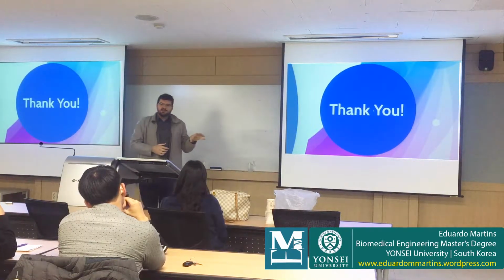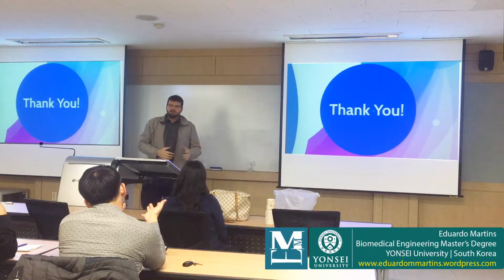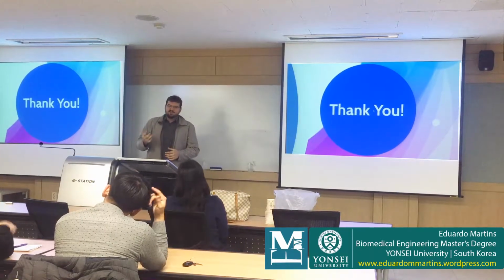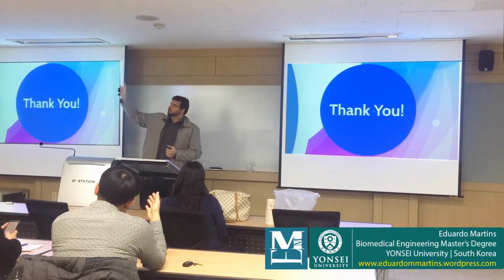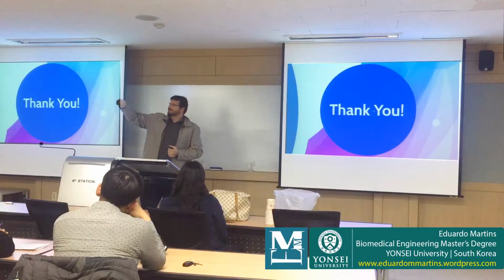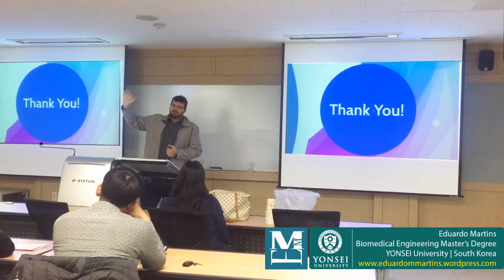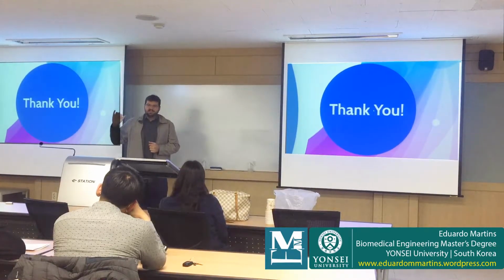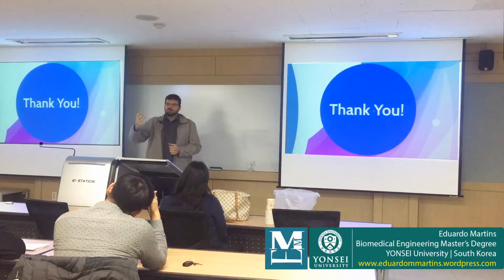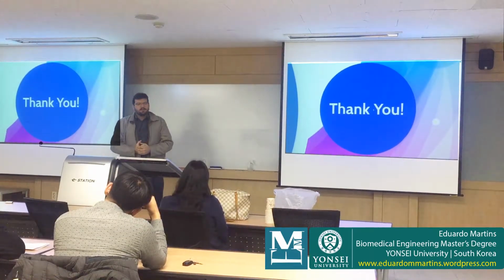Actually, nowadays bionic hands don't have independent finger movements. I tried to research many kinds of bionic hands on the internet, and the most advanced doesn't have independent finger movements. They have, for example, pinch and the whole hand, and some movement for the entire hand. But if you want to move only these fingers, you cannot do this. They have some presets, but it's very complex because you need to filter all the signals from the muscle, and it requires a lot of computational power.